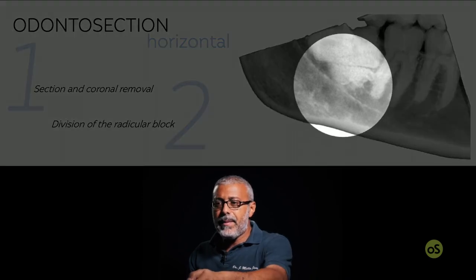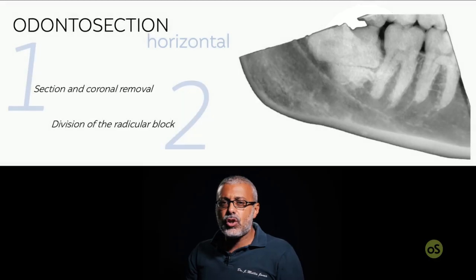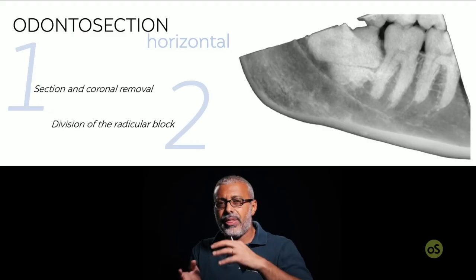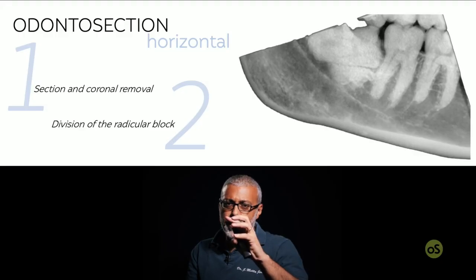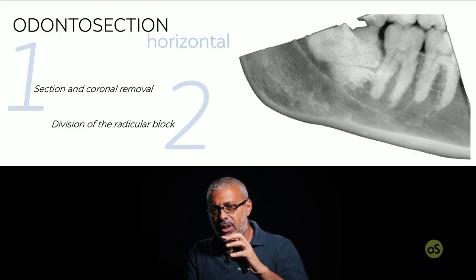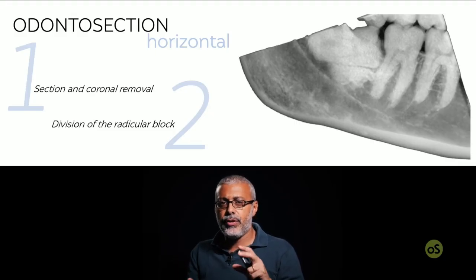because the mesial aspect of the wisdom tooth crown is going to be stuck under the equator of the 2nd molar. So this horizontal cut will make it possible to remove the distal aspect of the crown first and then approach the underlying mesial aspect of the crown. And then we will have to approach the roots.